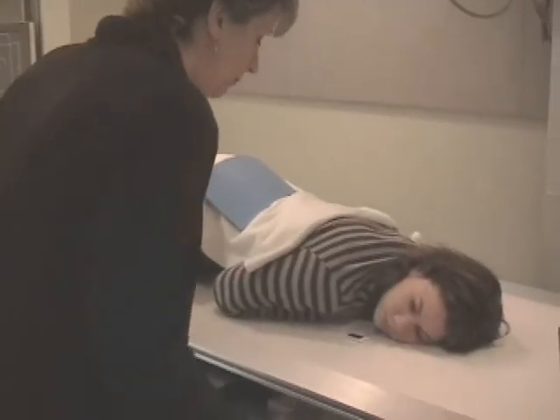I need to squat down and look at my patient straight on to get those reference lines where I want them. Then I need to move quickly to get the cranium centered. Again, I'll shoot for the film's edge being 2 inches above the vertex, but I'm going to find the cranium edges, find the vertex and the base of the skull, divide that in half, and center the cranium, in cases like Drea's where I can find the borders. So we're going to readjust here for a second.